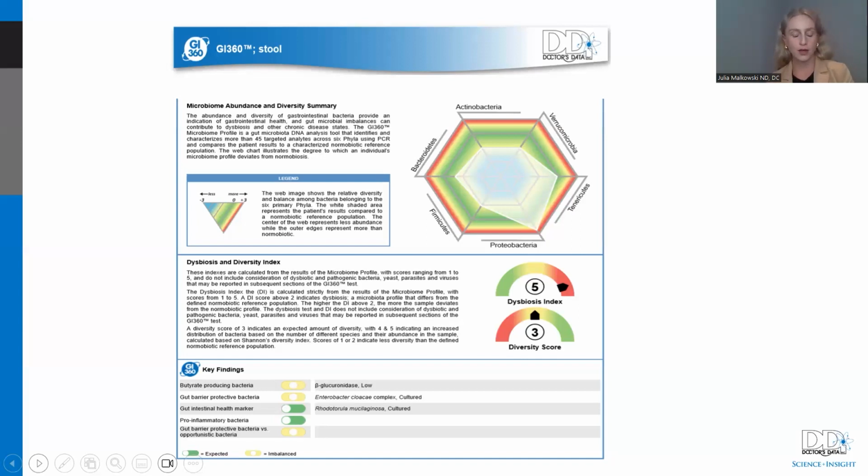The second column, though, is additional findings on the report. So stool chemistry, cultured bacteria, cultured yeast, like we have here, any parasites, viruses, things of that nature will be printed in the second column there, and that is going to be the significant findings of the report. So this is an excellent summary. Now let's go back to understanding this patient's results.